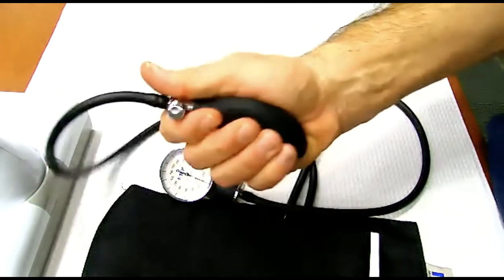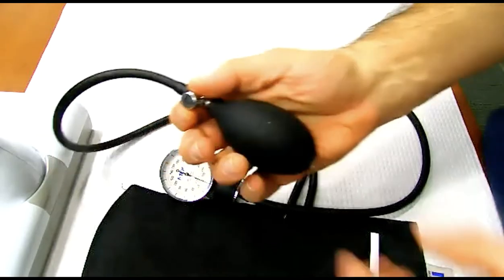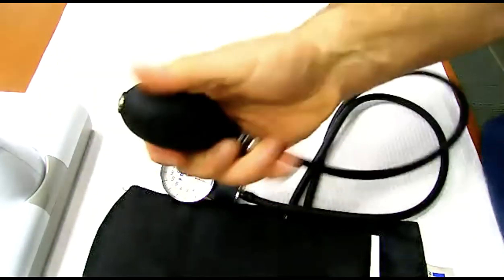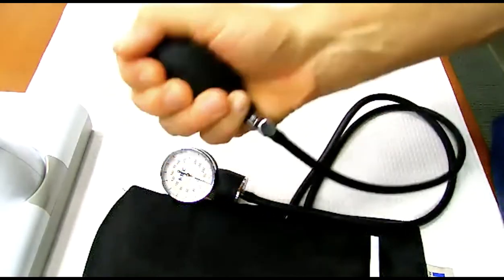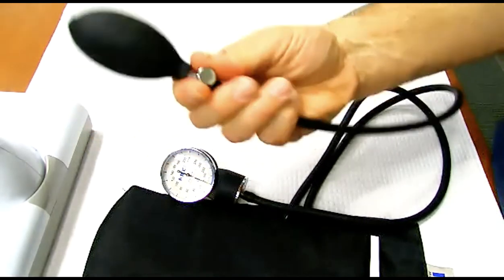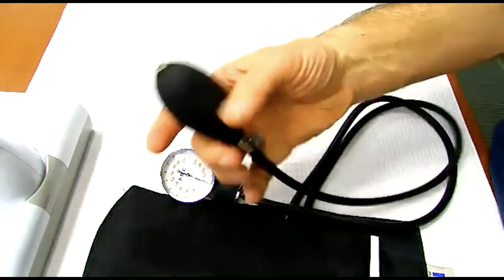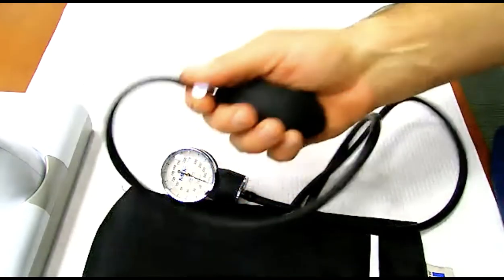And you'll notice I can go from squeezing to deflating here because my hands are in a good position. Now, invariably, some of you just like to do things differently, and I see a lot of people that hold it like this, where you do your squeezing, and that's great, but then how are you going to deflate it? Well, then they have to do this kind of roll, move it up and do it down here. Fine, you be yourself, but I think it was intended, instead of doing this whole up and down thing, just turn it around. Hold it like this, and your fingers are right there, ready to go.